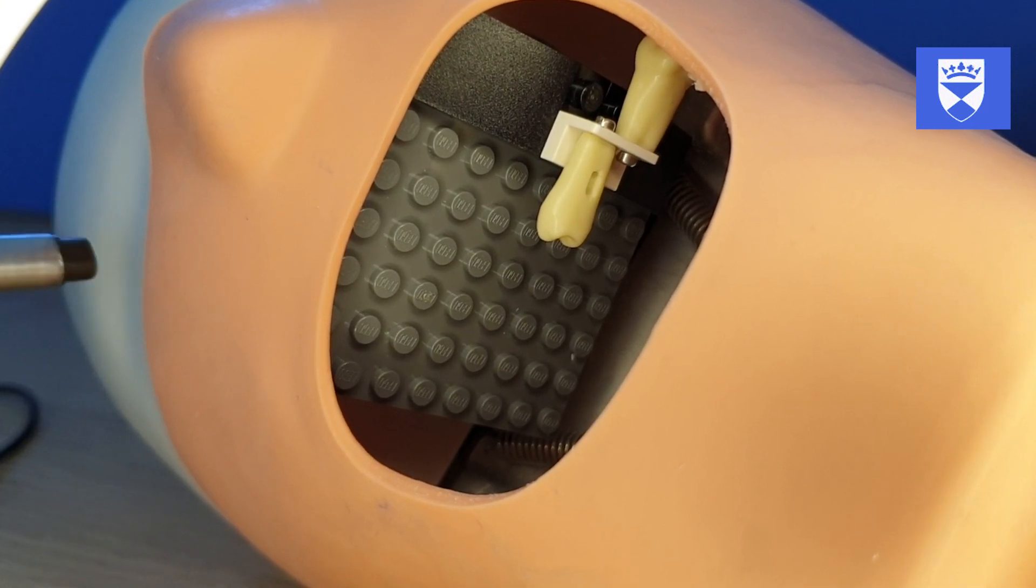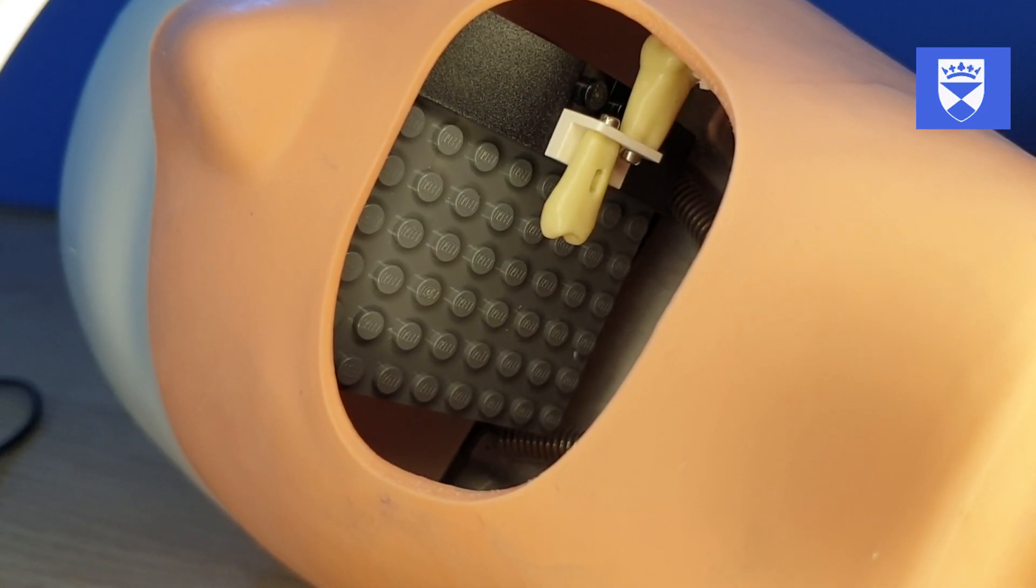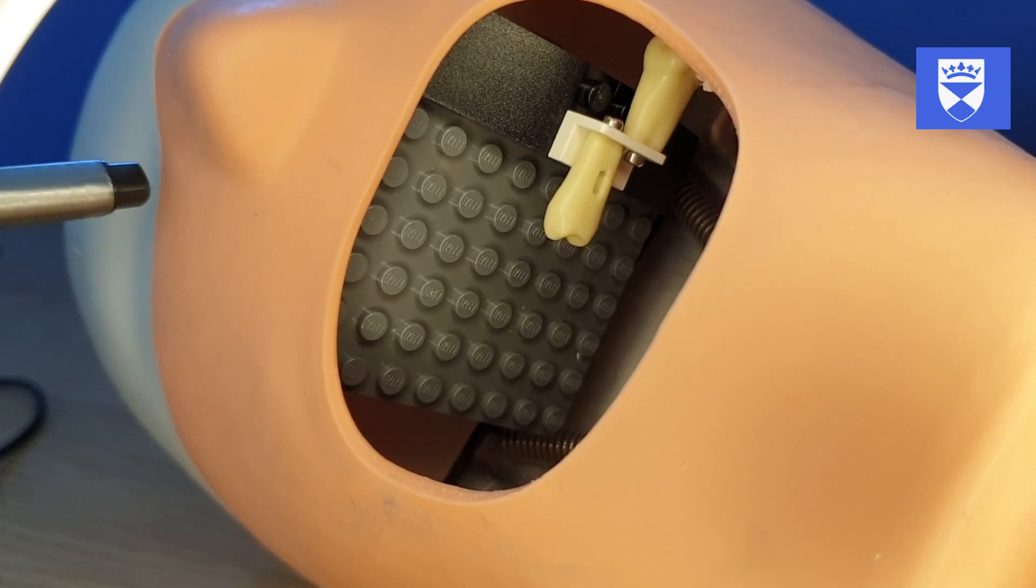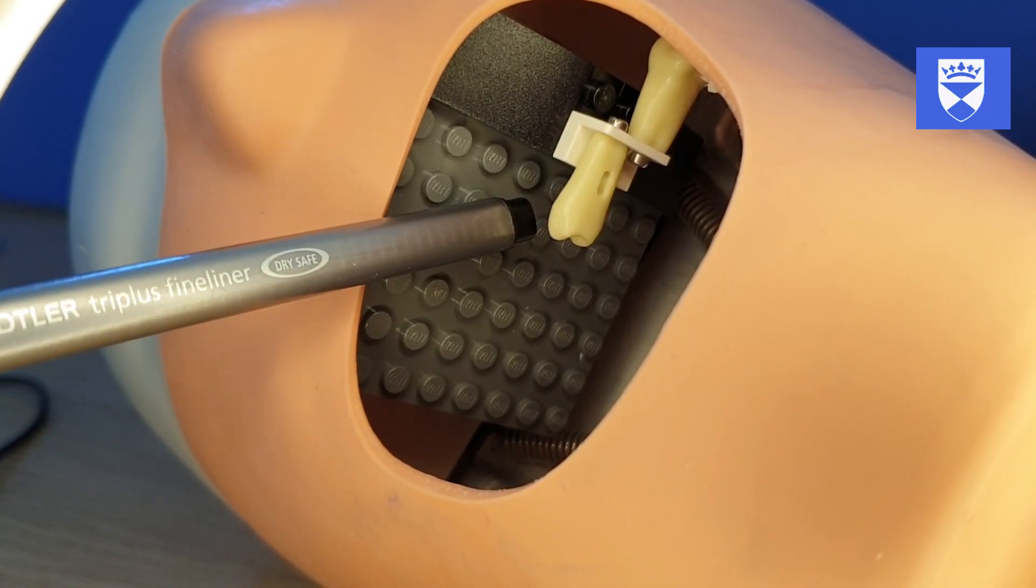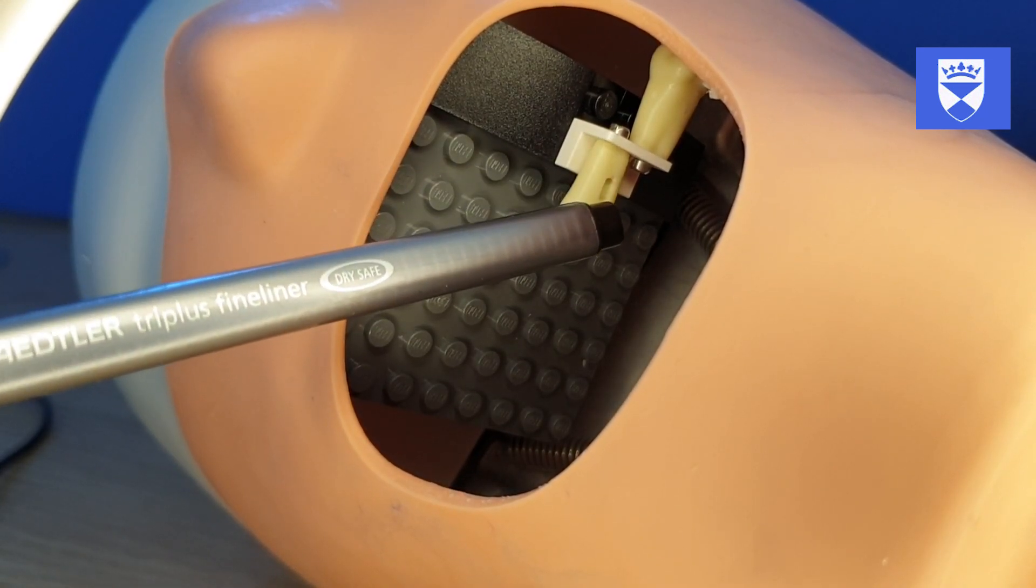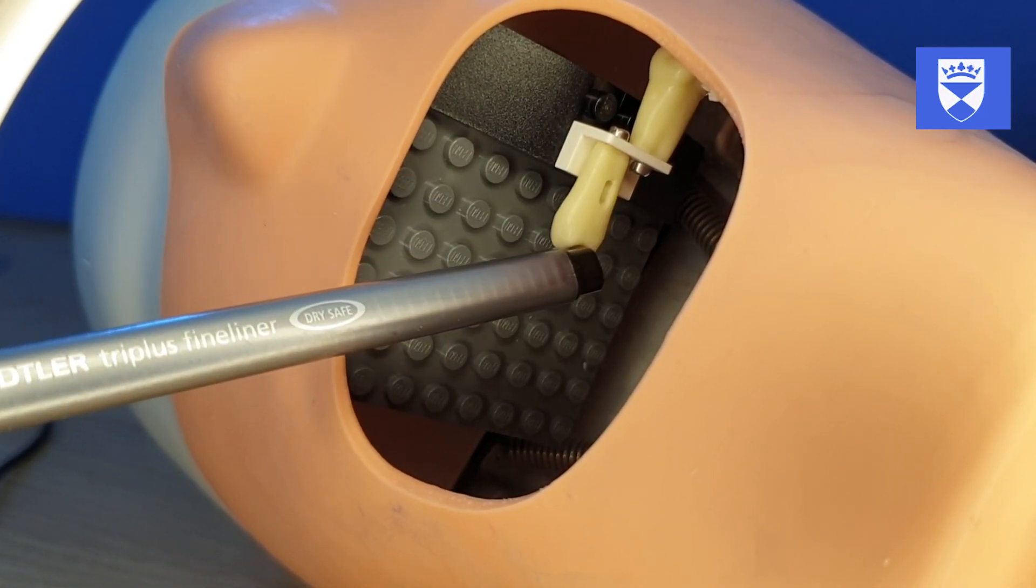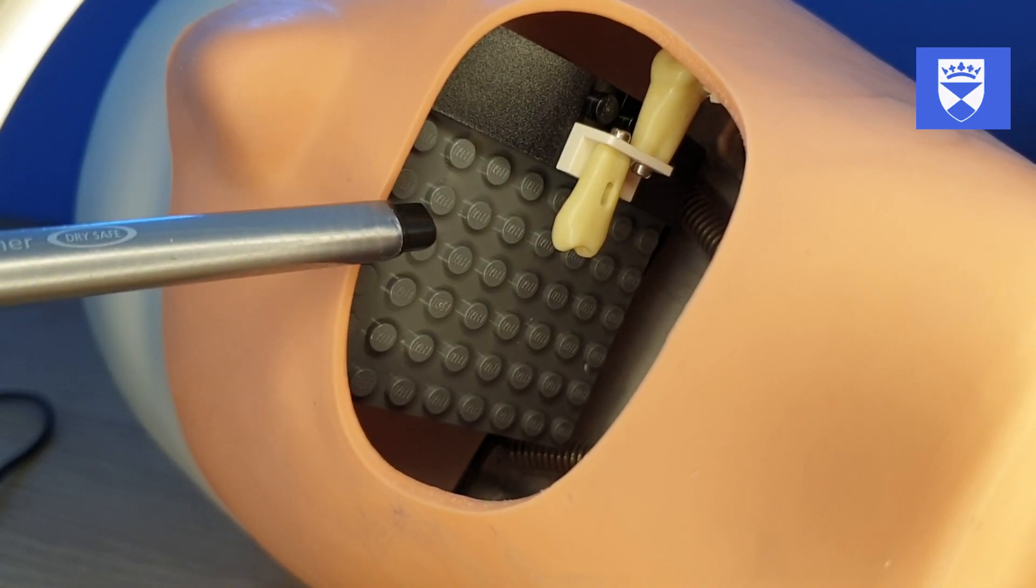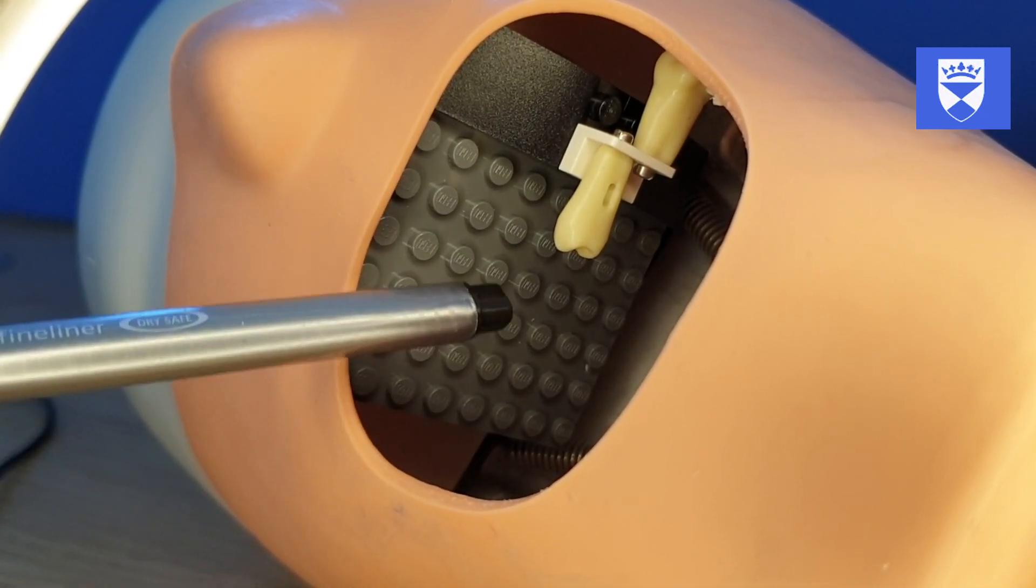Here you can see the modular universal mounting system mounted within one of our mobile mannequin heads. In this case we're simulating the maxillary arch. And the students can drill on the root surfaces wherever they want to in this arch. We can do it on the left, right, the anterior or posterior regions.